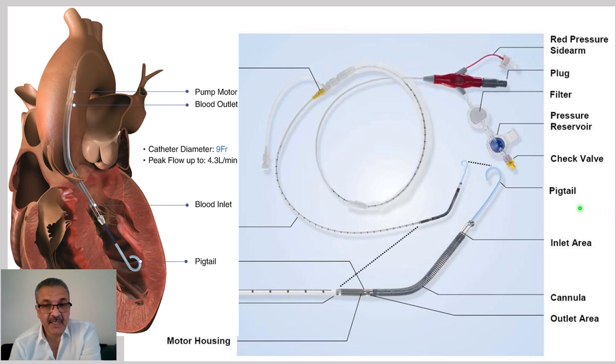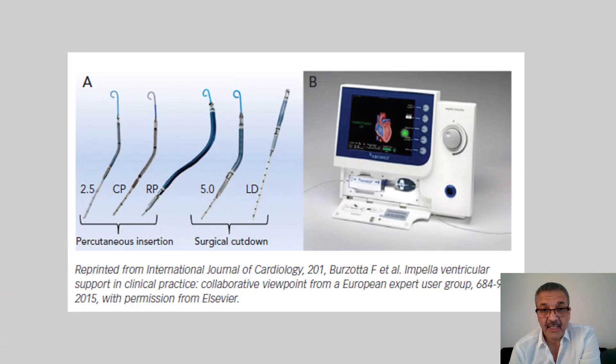Except for the Impella LD, as you can see, the other types of Impella have a pigtail — the LD Impella does not. There are five, or actually six, or even recently more — seven types of Impella.